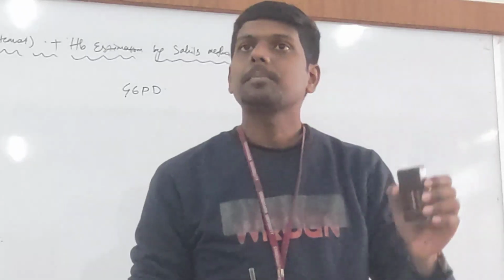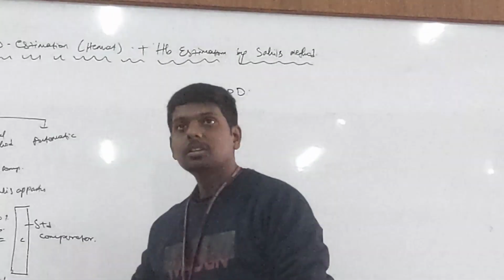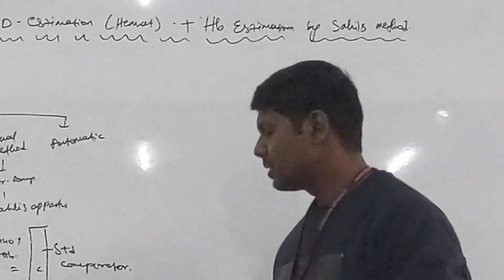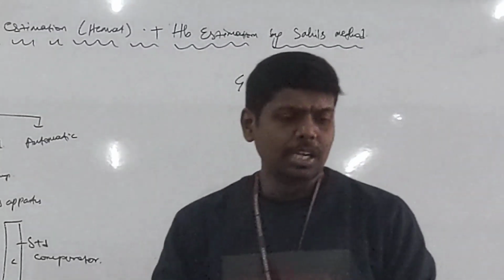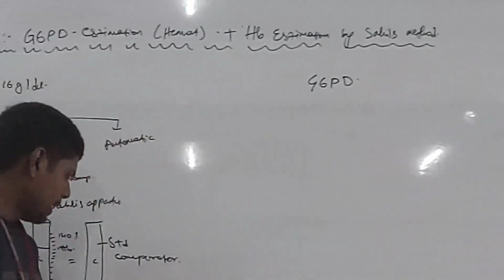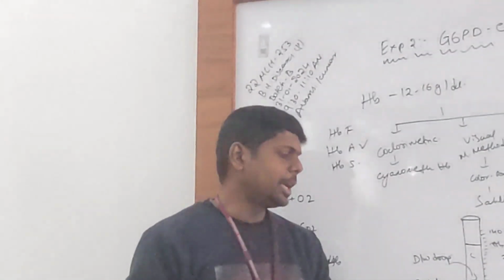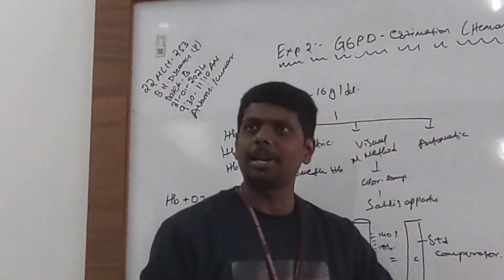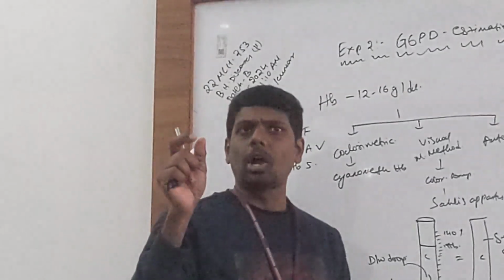Sir, I didn't understand the acid. The acid hematine you were saying, the formation since the acid addition, I didn't understand. Yeah, listen. First I already took acid, then I added a drop of blood. Now the blood became acidic. The hemoglobin became an acidified hemoglobin called acid hematine. That will be in deep brown color. It's a very thick brown color.